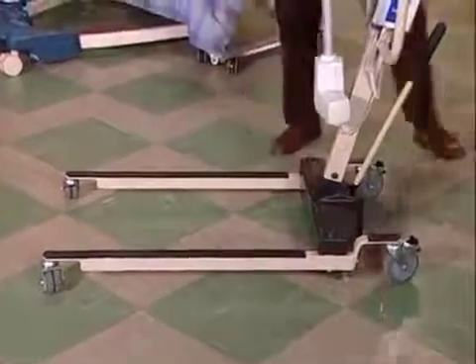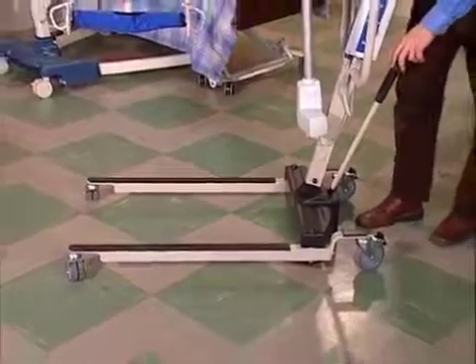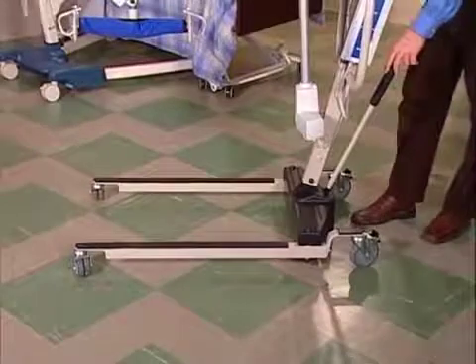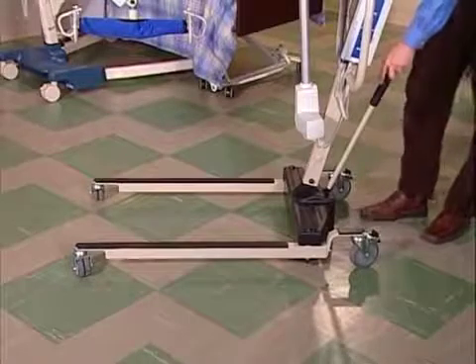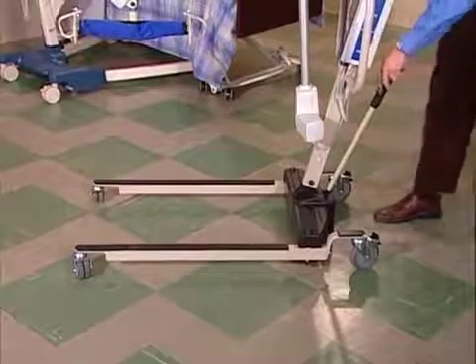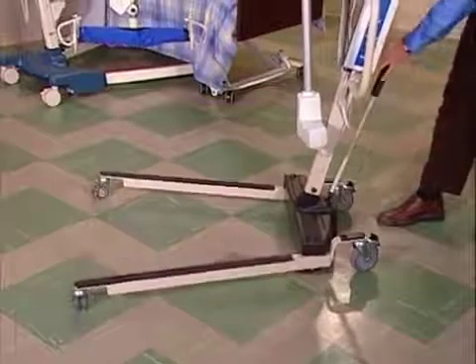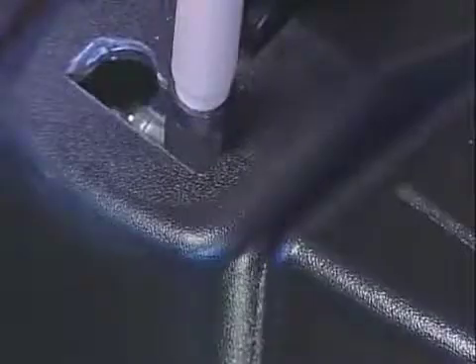To make adjustments on these, you have to use the padded shifter handle. It's pretty simple. To open the legs, grab the shifter handle with one hand and the steering handle with the other hand. Pull back on the shifter handle and move the handle to the right. The legs will open. Make sure that the handle drops into this slot to lock the legs into place.